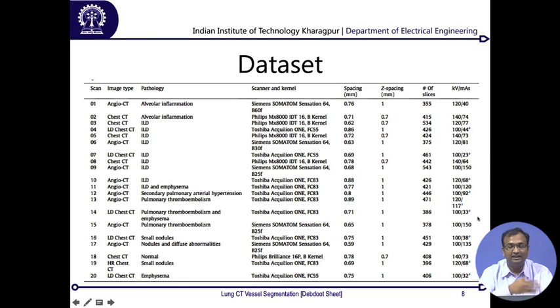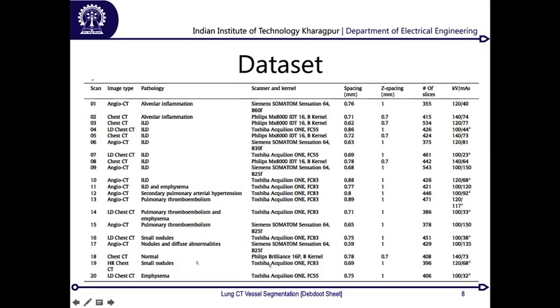So obviously the energy of the X-rays emitted from the X-ray tube within the CT when taking the CT was also different. So you have all possible kinds of variations which can happen in this kind of imaging environment, captured in the diversity of this particular data set.